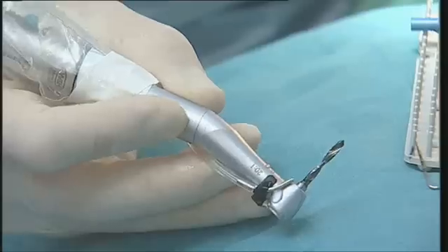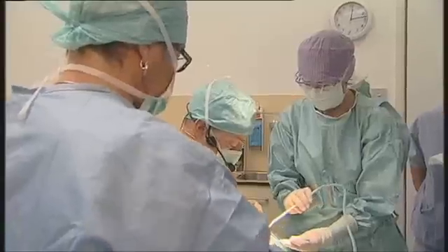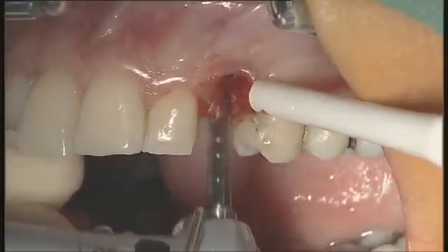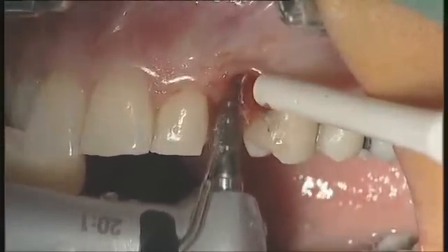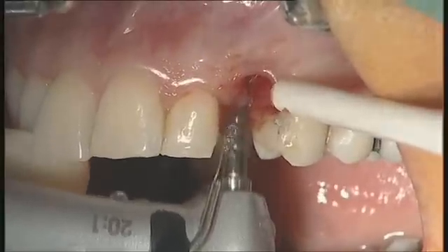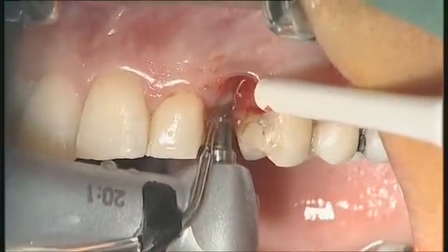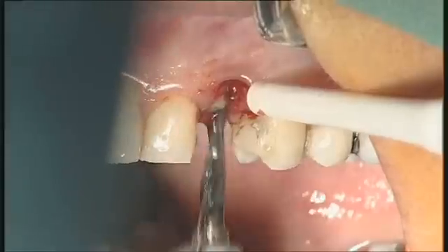This is the 2.4/2.8 drill — drill number two. Once again I start slightly palatal and correct my position later on.